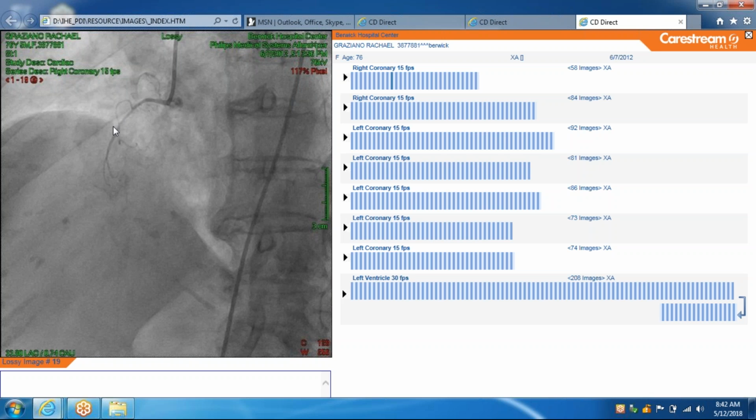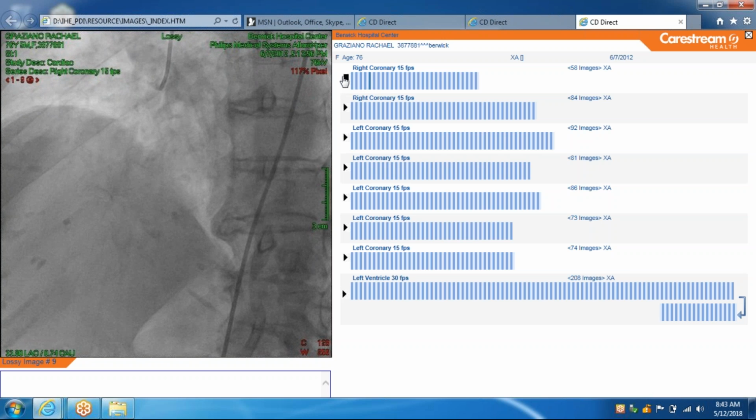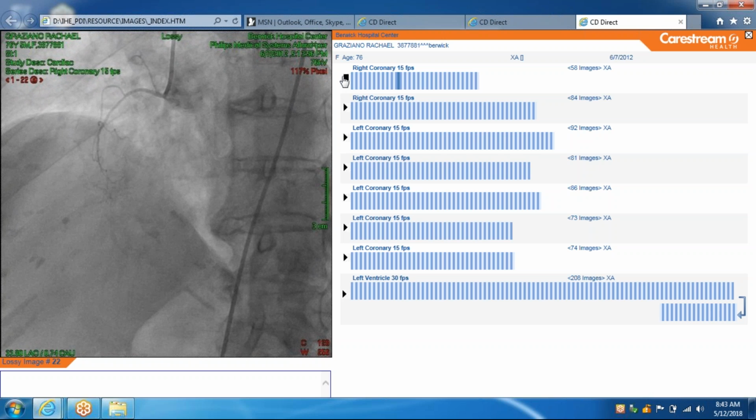So if there was a lesion here, we'd probably not do anything, because if we try to fix it, we may cause more harm than good. It's a very small blood vessel. It looks normal in terms of no obstruction, but it's just small, it's tiny.